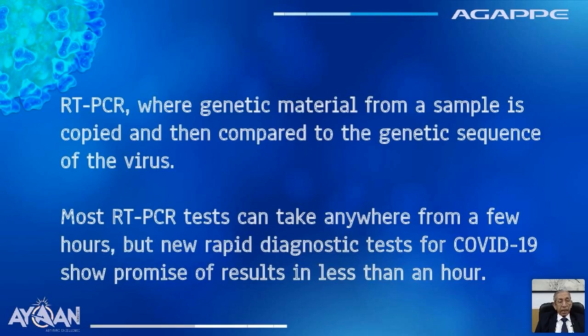Here, the genetic material from the sample is copied, that is, the RNA is copied to DNA. And then that DNA is compared to the genetic sequence of the original virus. That is the basic principle. And most of these tests can take anywhere from a few hours, usually 3 to 5 hours.